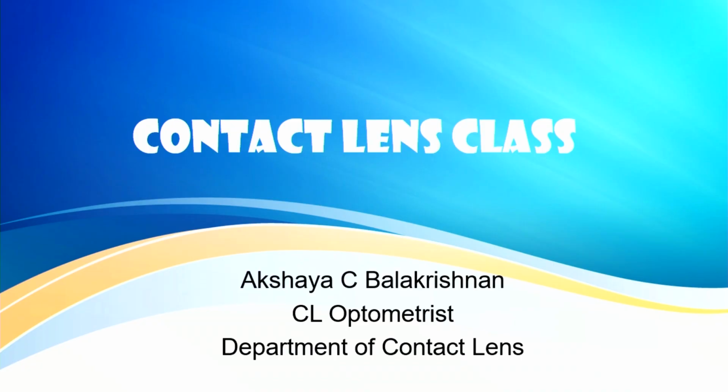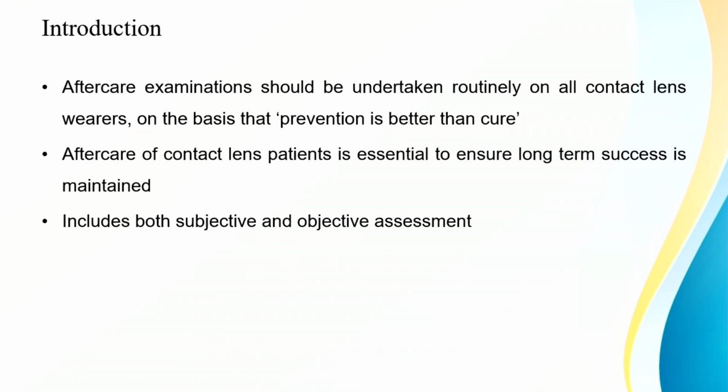Yes. So going with all those points, aftercare should be undertaken routinely to see that prevention is better than cure. Like she said correctly, whether the patient is using the contact lens properly, whether they are following whatever we have told them, how they are doing it, whether the protocols are being followed, we have to see that. Then next, we have to ensure that the contact lens wear is successful.